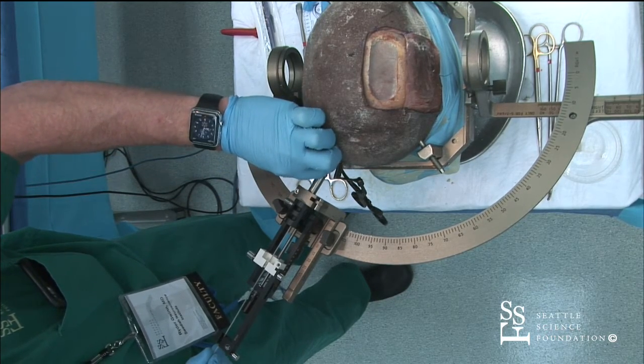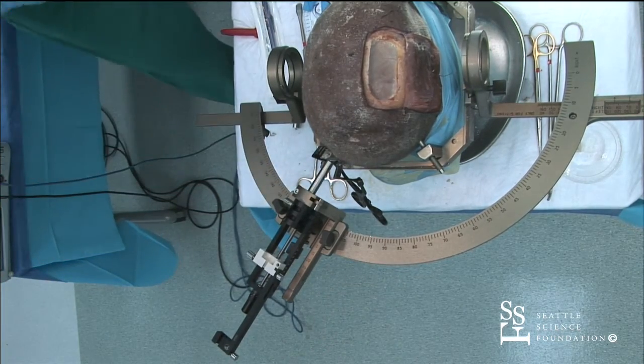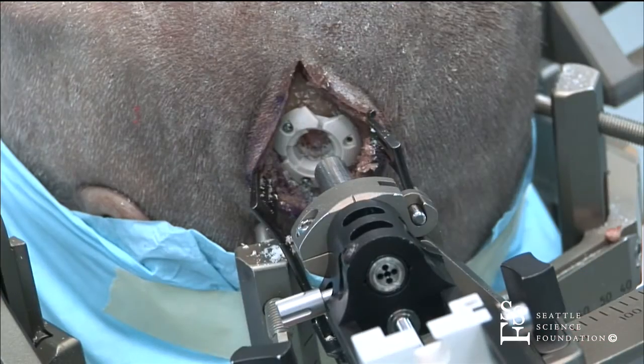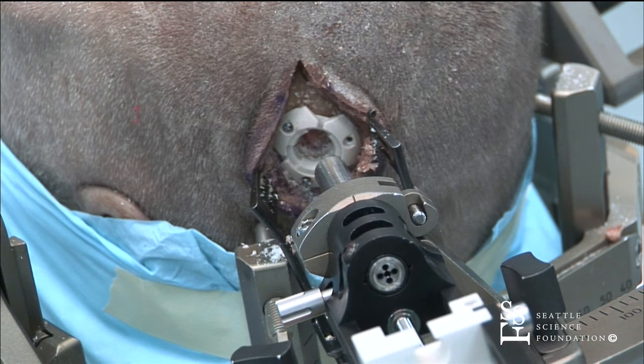And normally I would, oops, hold on, I need my cannula. Do you have the cannula over there as well? That's the operator. Oh, here it is. Oh, great. Grab that one too. One of those might be the sharp one. Does this have a top to it? Oh, yeah, it does. Great.